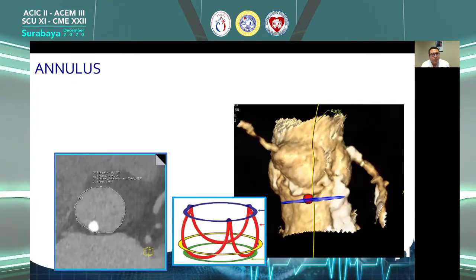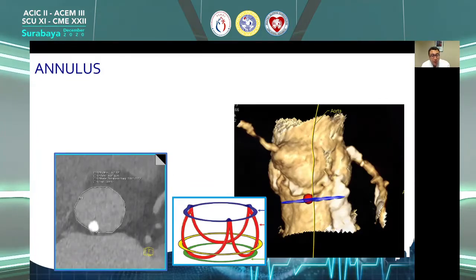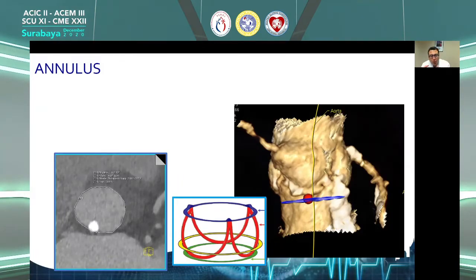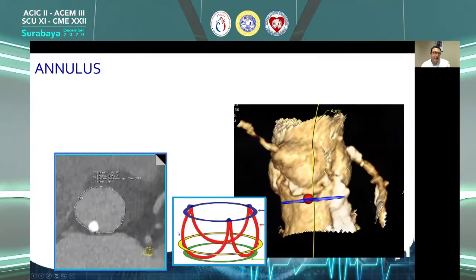Looking at the annulus: cardiologists have learned a great deal about the aortic annulus through TAVI and CT for TAVI — the details needed to adequately report different dimensions and anatomic information for the procedure. The aortic annular plane is not a structure you will see in CT; it is a virtual plane that connects the cusps and hinge points — the lowermost points of the three cusps — connected by a circle representing that virtual plane. The sinuses and the lowermost points of the three sinuses define the annular plane that must be adjusted in CT.